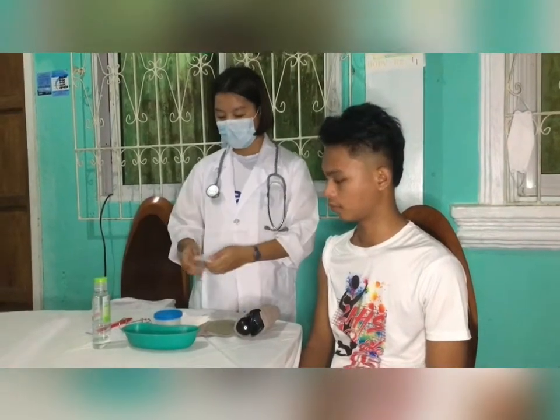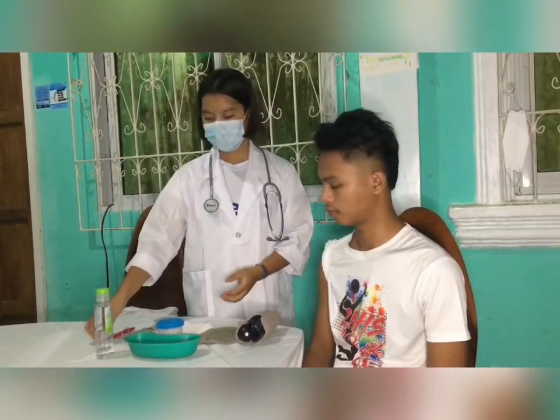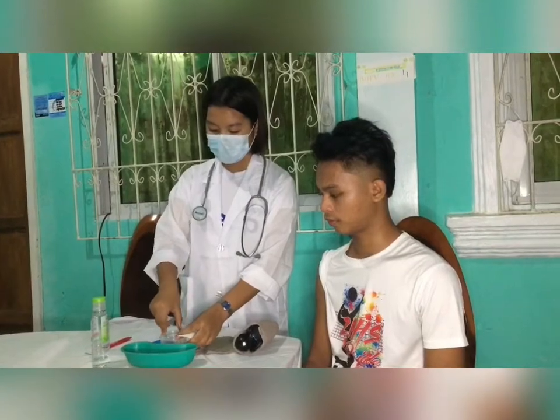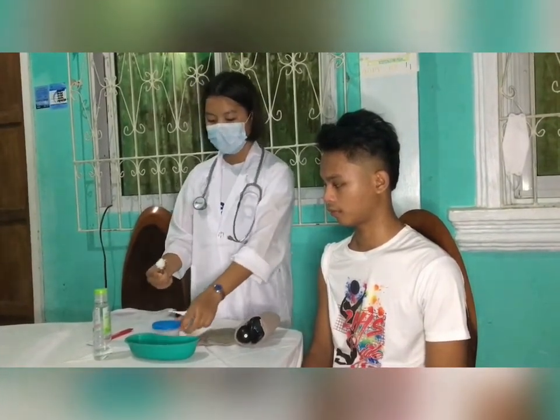Remove the thermometer from the container. With the cotton ball, wipe the thermometer in a rotating motion from the sensor to the neck.